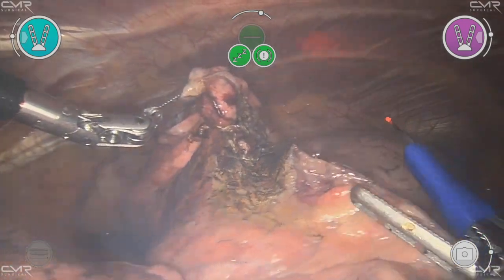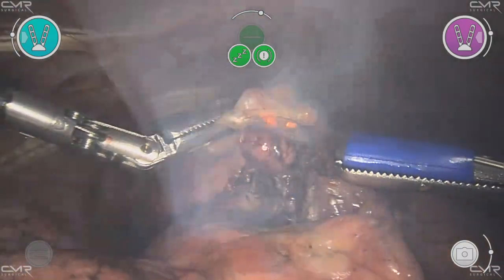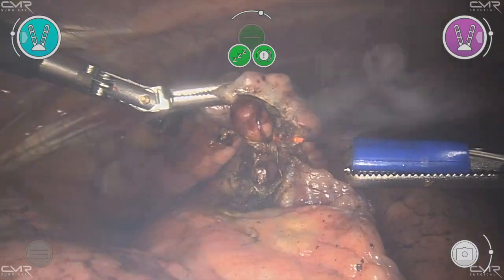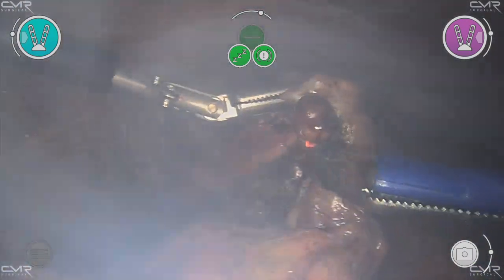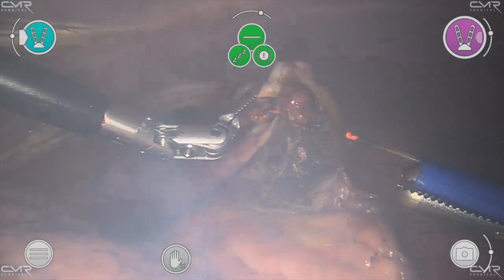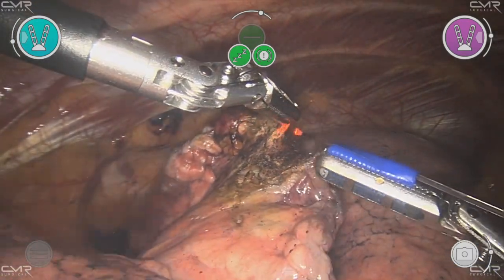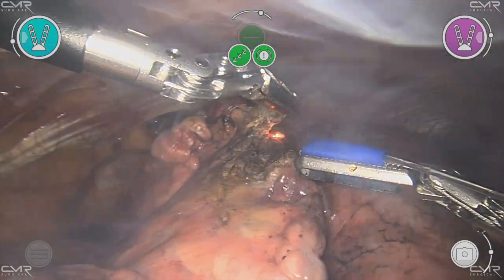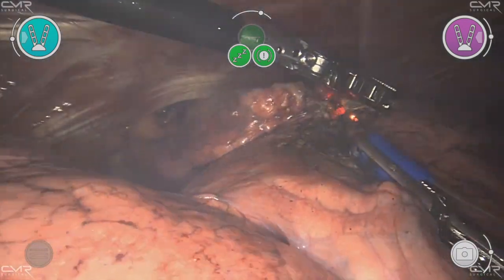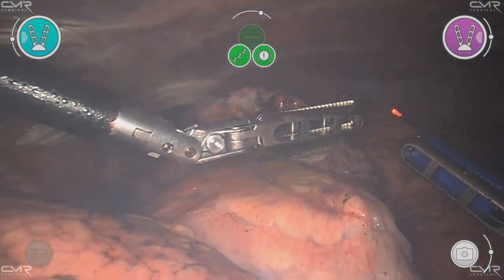You can see the three icons at the top - the green instrument unit is on standby but in sleep mode as we're not using it. When Sven does use a third arm it's very different to other systems, because other systems have to go in a line whereas the CMR system is more versatile than that. Sven's found it most useful, if he wants a third retraction arm, to place it in either the third or second intercostal space anteriorly - so very high up really in the chest. If we did have a third arm in it would be above where we're diatherming right now, just lifting straight up. That's working really well for him and has also worked really well in cadavers - and I think that will end up being the standard approach.